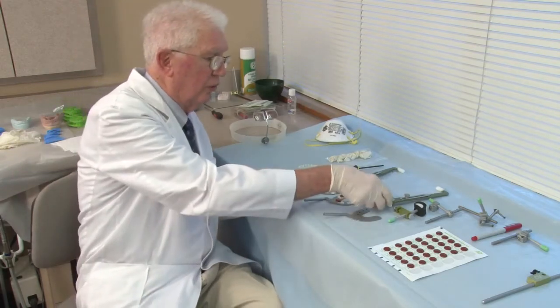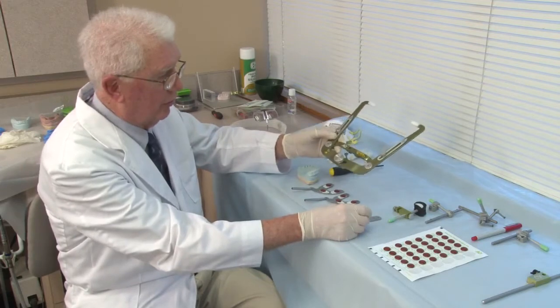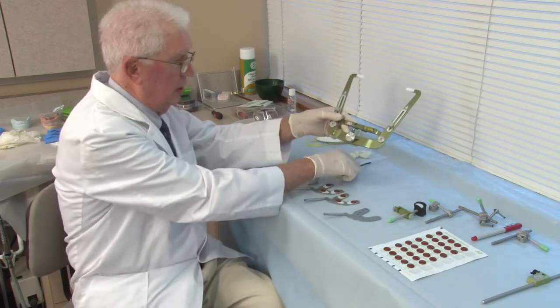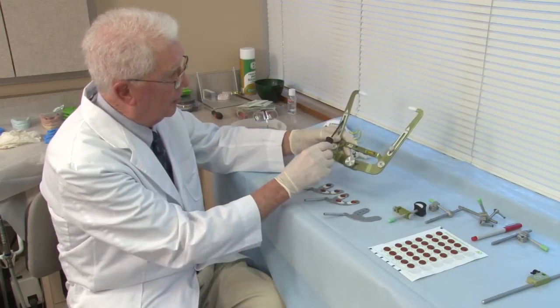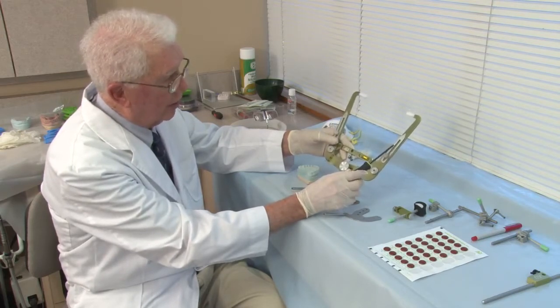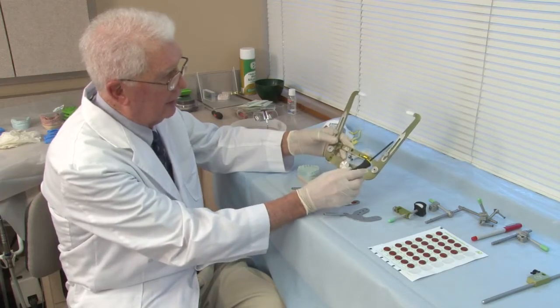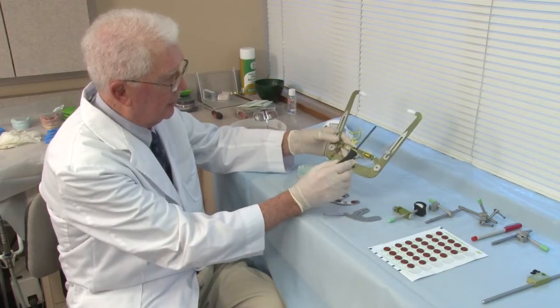You also want to have your ear bow set up and ready to go. Remember, now this is your estimated face bow or ear bow. We have our orbital pointer, and when you're doing a hinge axis, you'll have an orbital pointer on both sides of the ear bow. This extra orbital pointer comes in the hinge axis kit.